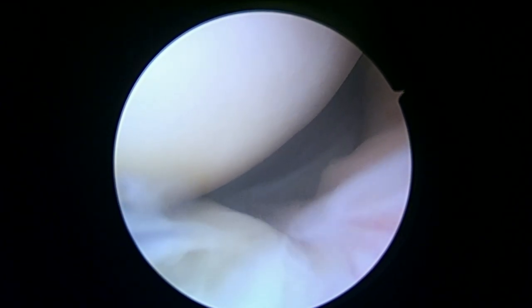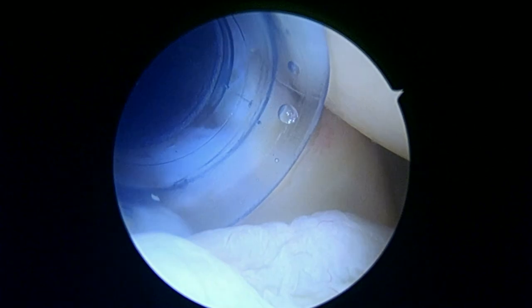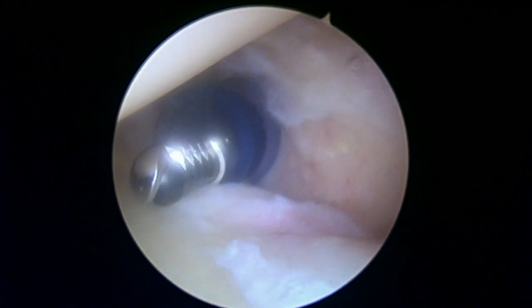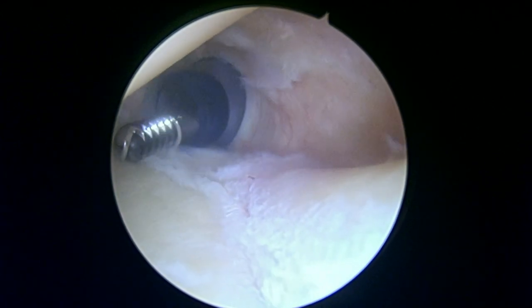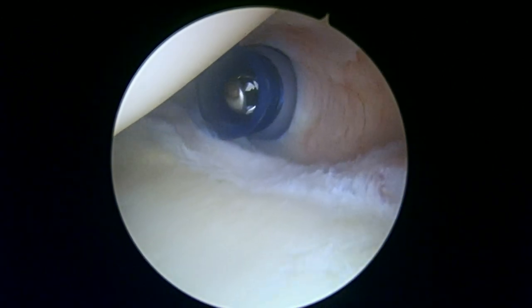Here is the posterior anatomy — that looks pretty good. You've got a little bit of posterior labral tearing there. What we're going to do next is put the camera in the front and have a look from the front to the back. Now we're looking from the front to the back. This is the posterior aspect of the joint — this is the posterior labrum. I think that's going to be okay.